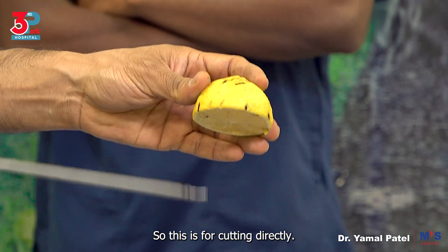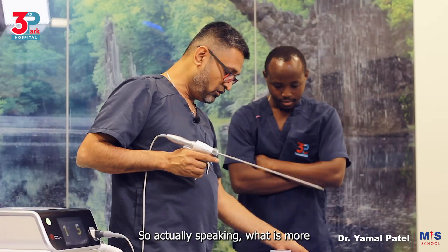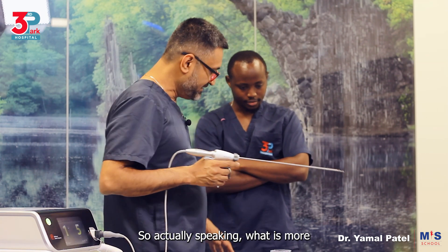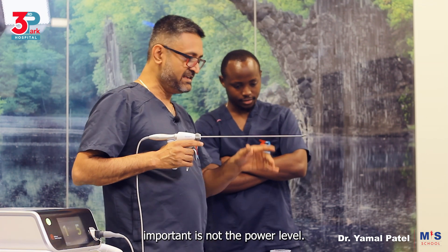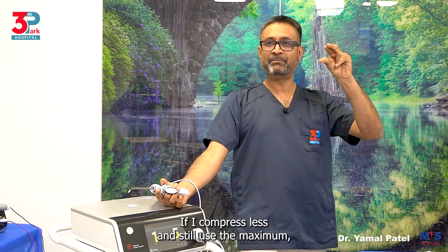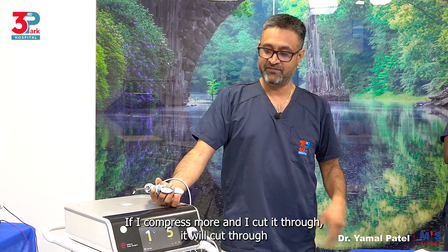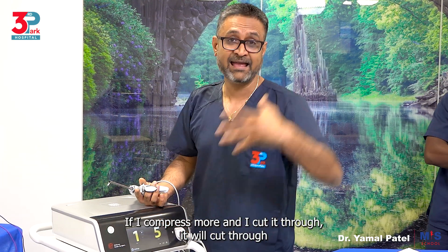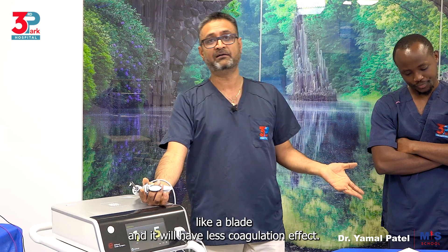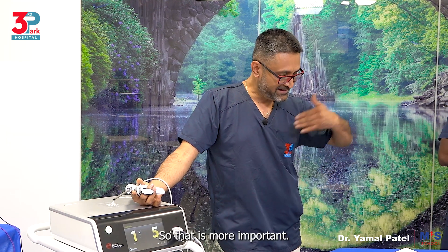So this approach is for cutting directly, and the other is for coagulation and cutting. What is more important is not the power level — what is more important is the compression level. If I compress less and use the maximum, I can still get a coagulation effect. If I compress more and cut through, it will cut like a blade and have less coagulation effect.